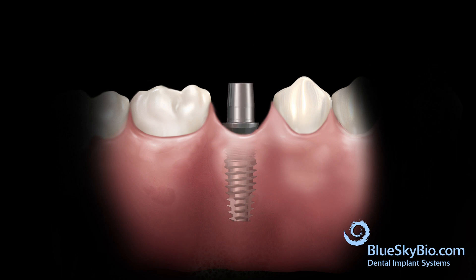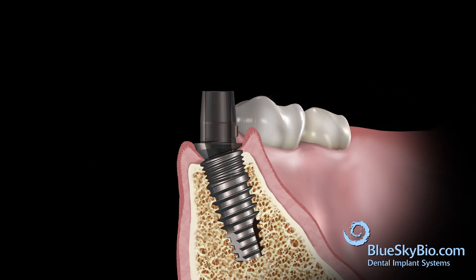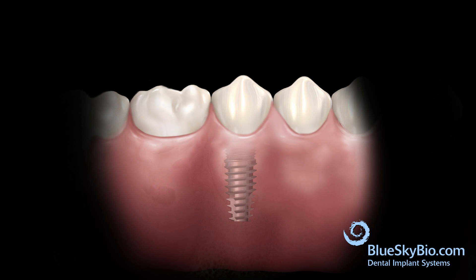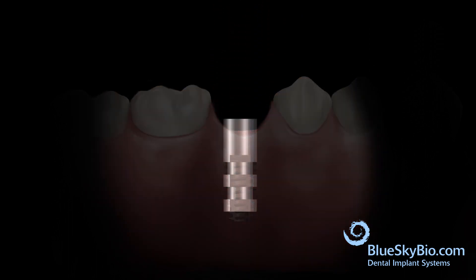Insert the abutment into the implant and tighten the screw with light finger pressure using a ball tip screwdriver. Place the crown on the abutment and remove interproximal and occlusal interferences. Remove the crown and the abutment.